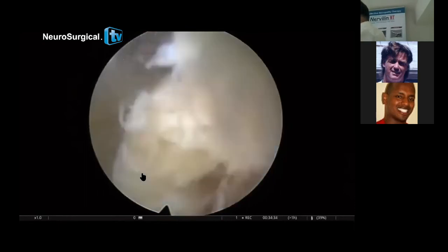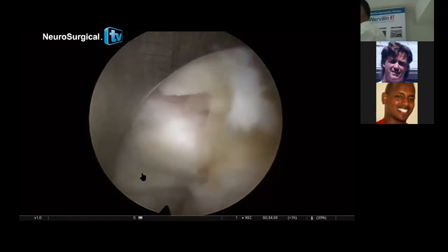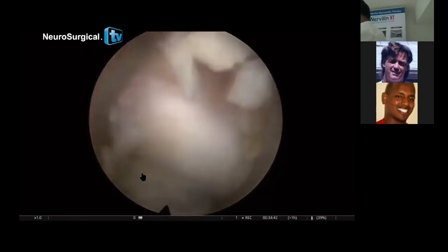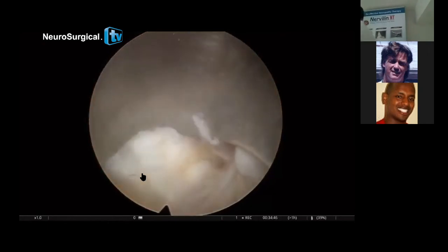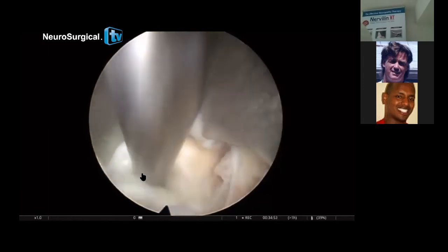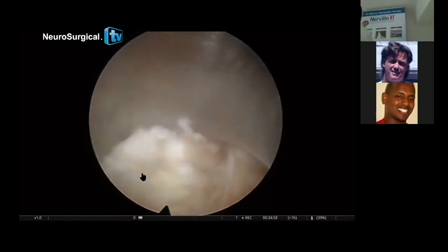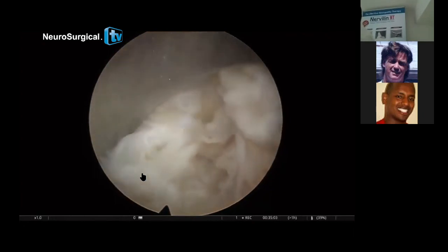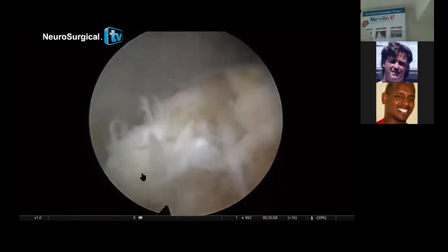Yeah? There's the nerve structure. You must control it just by turning it, as you use it as a joystick. And now I took the disc inside. Nerves are all midline, so I can really work safe. And you always relax the nerve roots every 3 or 5 minutes.